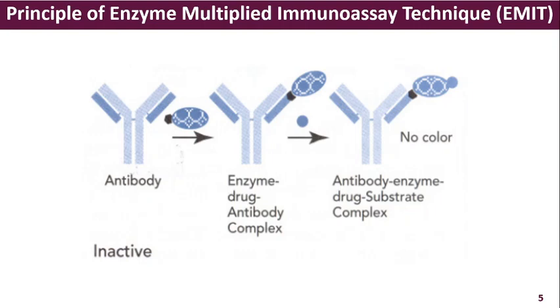First, you take the sample to be investigated, and that sample, let us presume that it contains a large amount of the suspicious drug that you are looking for, and to that sample you add the antibody corresponding to that drug and incubate it for some time, mix it well, incubate it for some time. Later you add now the drug enzyme complex and once again incubate for some time, and then now visualize the reaction.